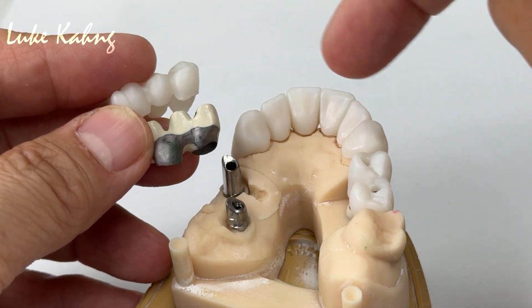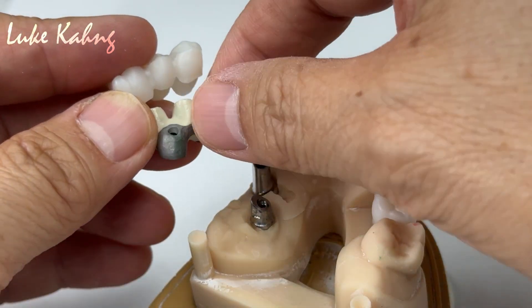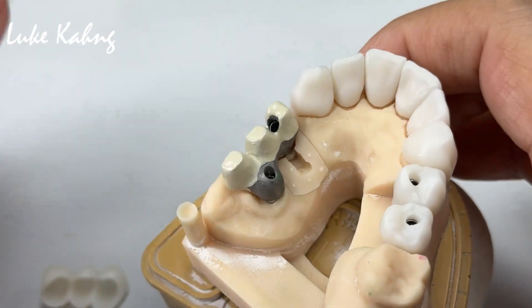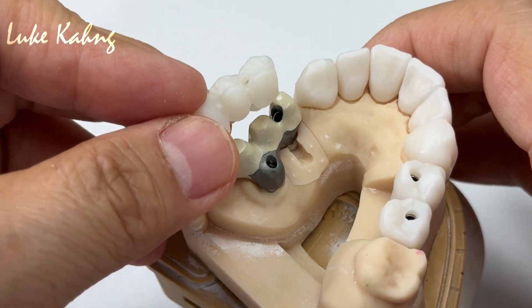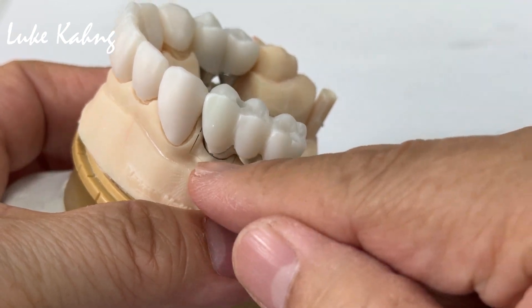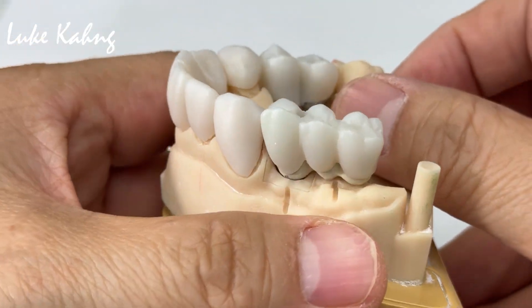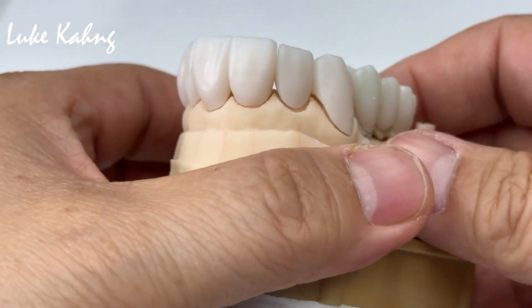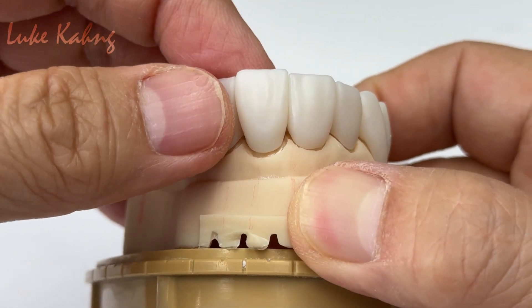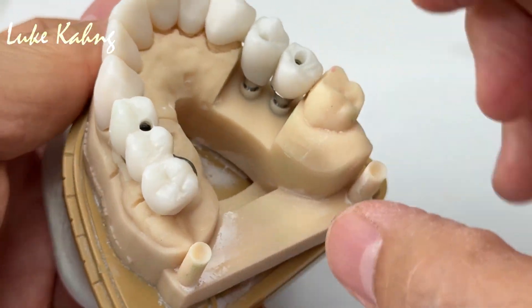We design and fabricate a custom abutment. Due to the lingual position, we need another crown over the top of this — we're going to cement it. We're never going to fail on our restorations. On top of this, we use a 3-unit bridge, adding the pink gingival area monolithically. Now we shape down in more detail to get better restorations, as seen in my previous YouTube and membership videos.